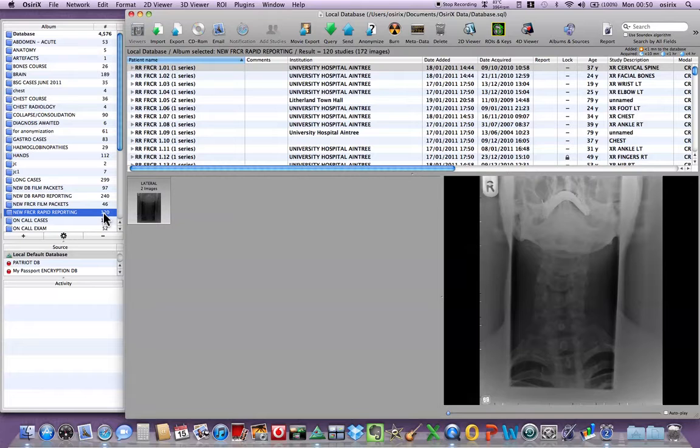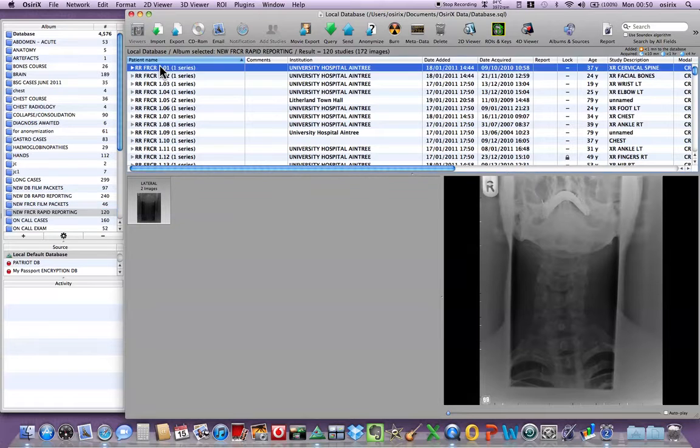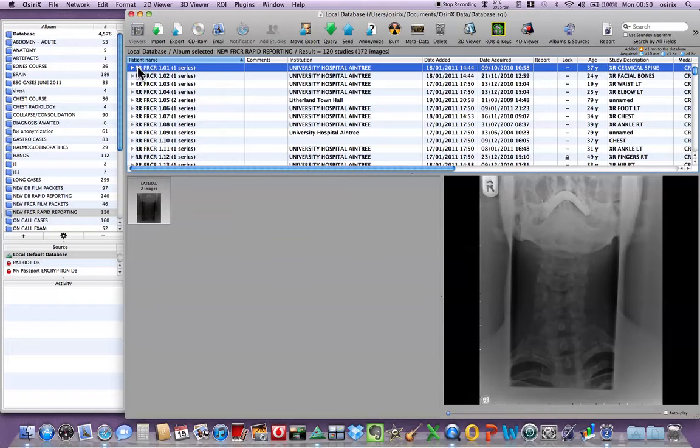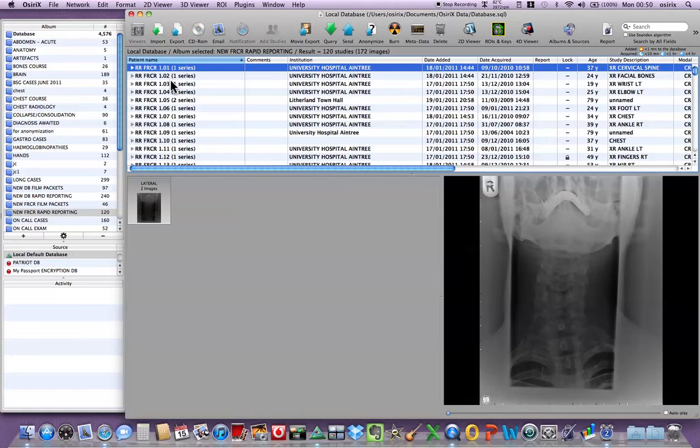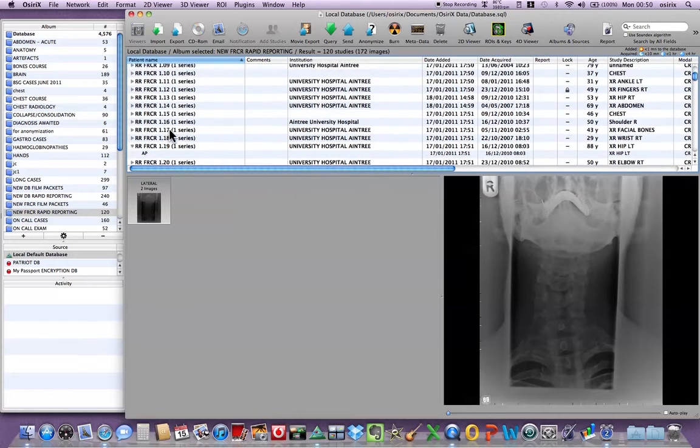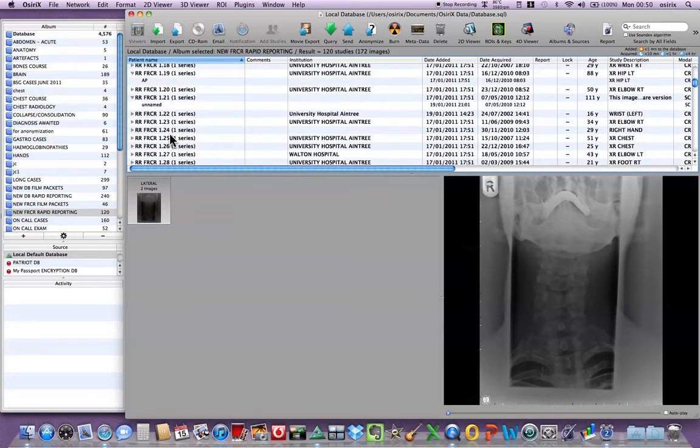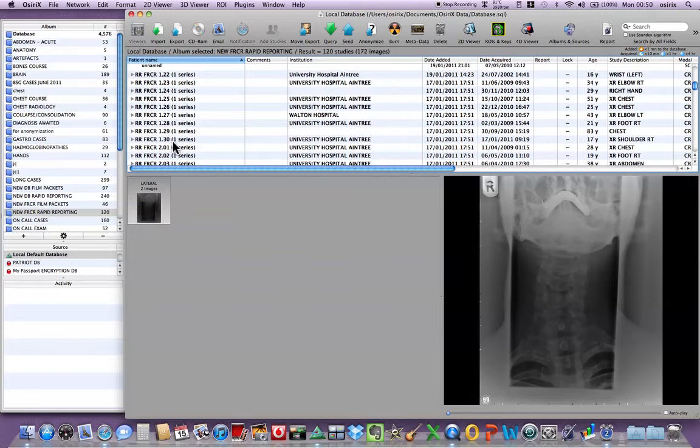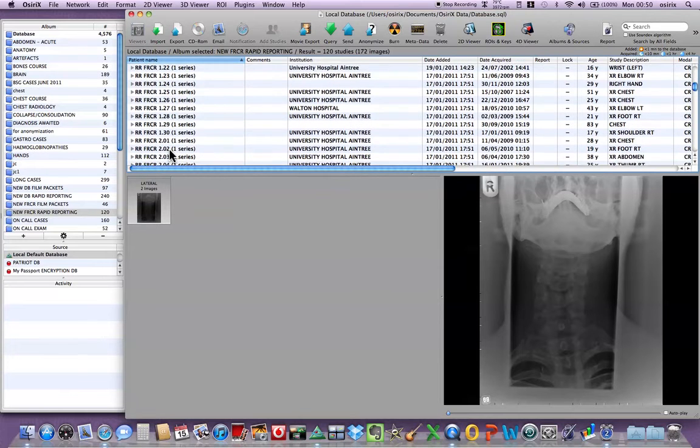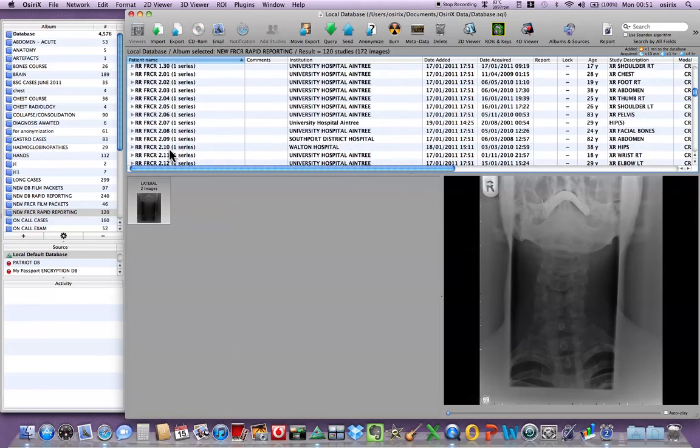In the real exam you have one packet with 30 cases and this is for lots of those examples. What I've done is I've changed the patient name to rapid reporting FRCR 1.01 and this goes sequentially down to 1.30. Further packets are entitled 2.01 to 2.30, 3.01 to 3.30 etc.